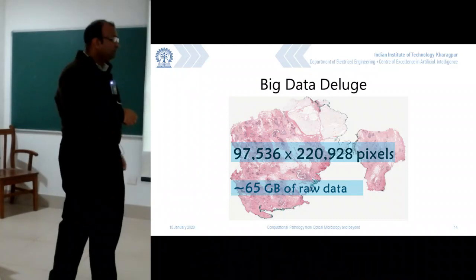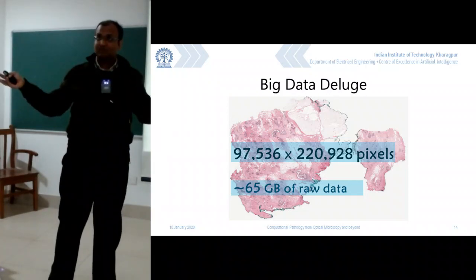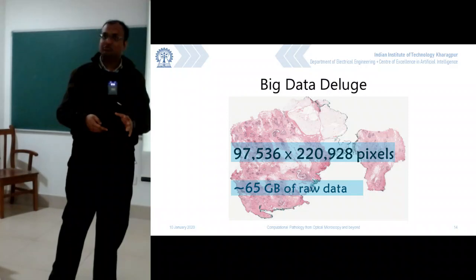Now, until I am able to very accurately map, I will not be able to resolve between those 4 pixels. So I will have more pixels, but my resolution will not increase because I am not able to resolve between 2 points over there. So this is the problem which we are trying to solve over here.